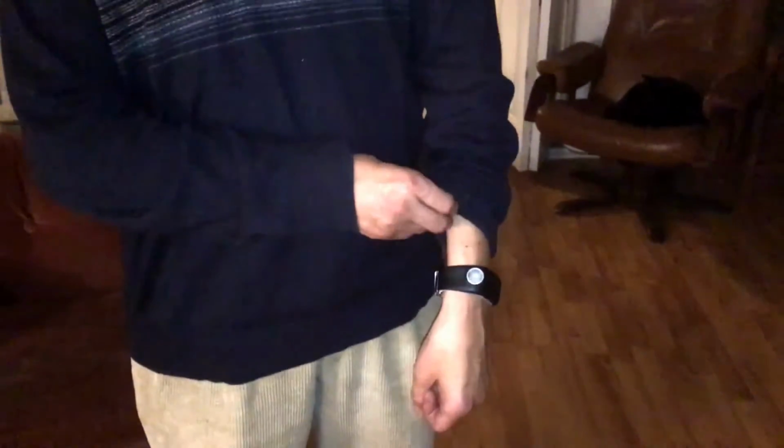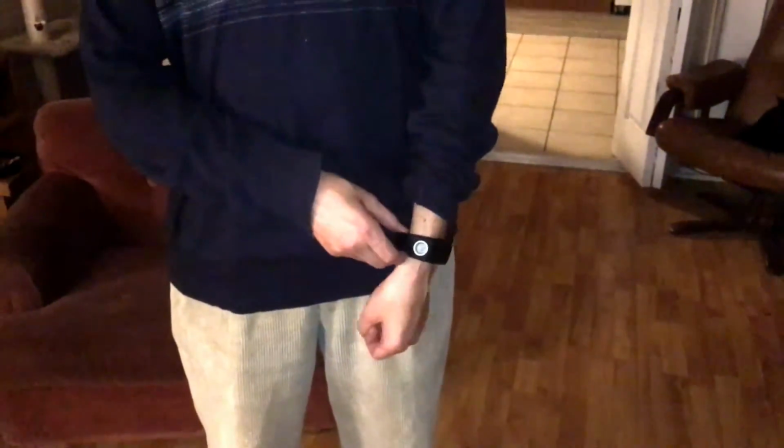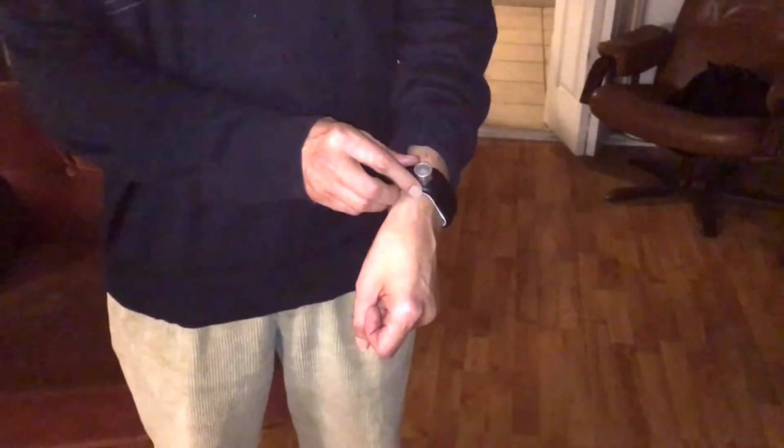This is the only device that has an accelerometer built in, the only device that I know of anyway, so the band knows its position in space. So if, for example, you orient the device at a roughly 45-degree angle, if you are at long range, it will actually switch to short range so that you can detect overhanging objects that are at an approachable distance. So it does this sort of smart thing where it says, okay, I've been angled this way, so I don't need to detect 4 meters up into the sky. I'm just going to detect objects that would be at the user's head level.